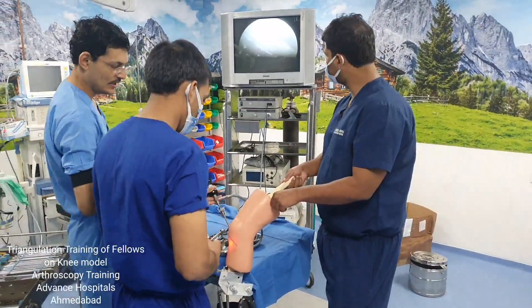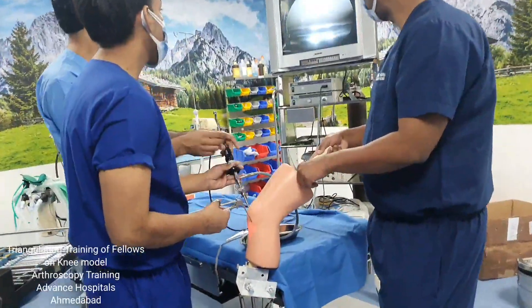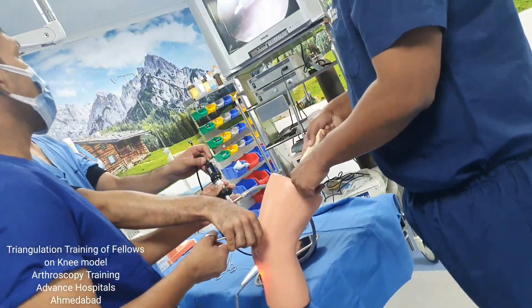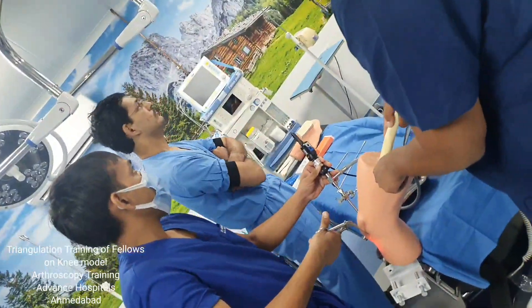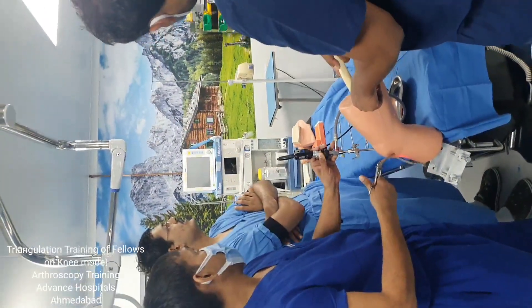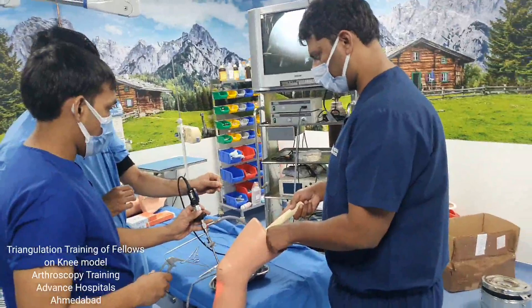You can hold the grasper like this, then place your scope. Now focus on the tip of the instrumentation — the tip should be in your field of focus. You can hold smaller loose bodies like this and grab onto the particle. He has successfully removed this loose body from there.